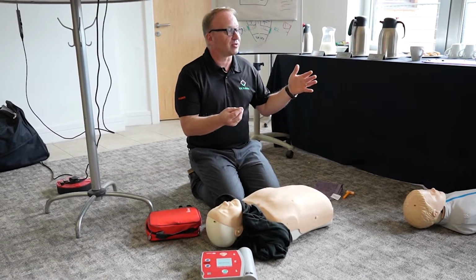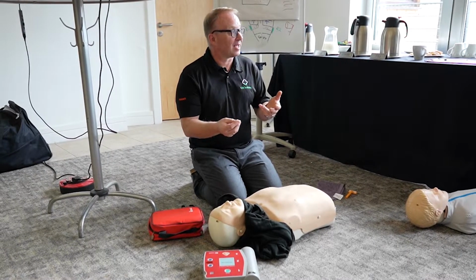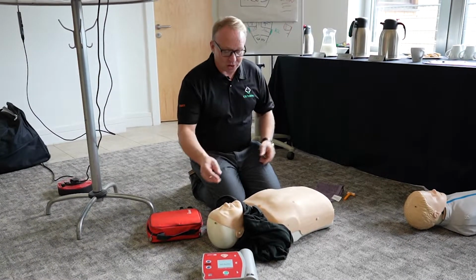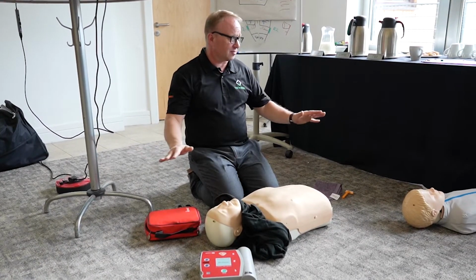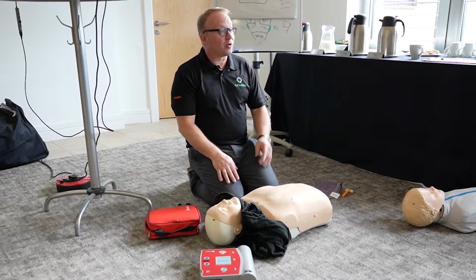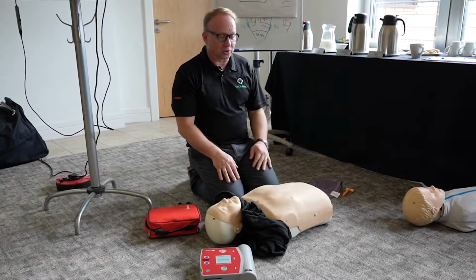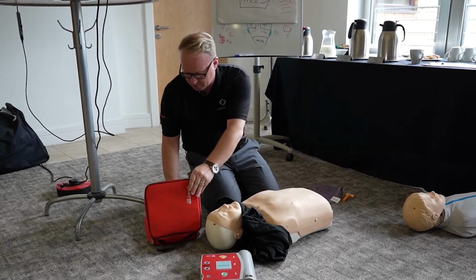What's the word that comes before glycerine? Nitro. Nitroglycerine. What's that? An explosive. What's this? A charge. Please take all the patches off. Just take every patch that you can possibly count. There is more and more consideration, but we'll come to it in a minute. All right, so listen to what it has to say, and then do what it says.